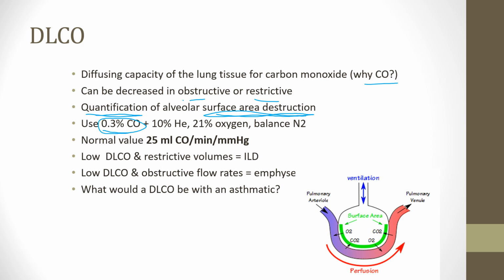We're going to use 0.3% carbon monoxide. Why do I make a big deal about this? This was actually a board exam question I got. What is the concentration of carbon monoxide used for a DLCO? It is 0.3%, not 3%, 0.3%. They were trying to get me there. They also use a mix of helium, oxygen, of course at least 21%, and the rest of it is nitrogen in there.